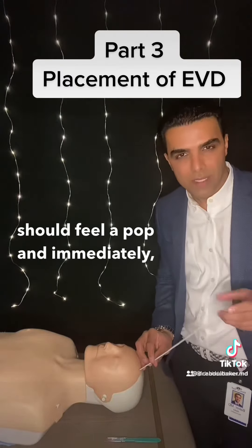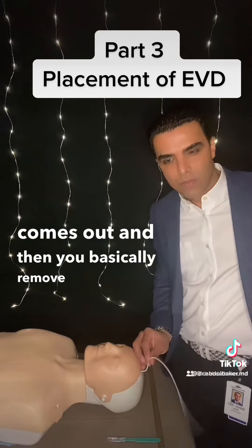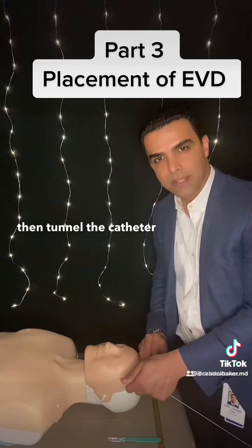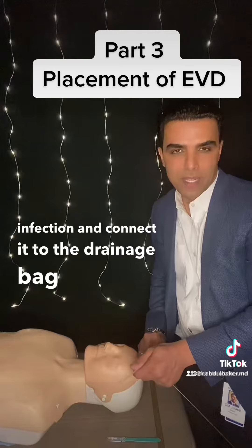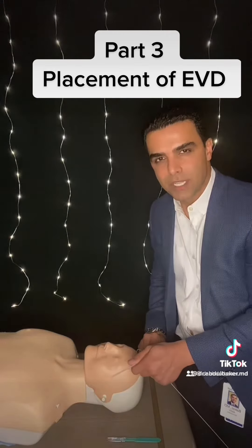And you should feel a pop, and immediately spinal fluid comes out. And then you basically remove the stylet, and then tunnel the catheter laterally to decrease the rate of infection, and connect it to the drainage bag. I'll have a separate video about the drainage bag and troubleshooting ventriculostomy problems.